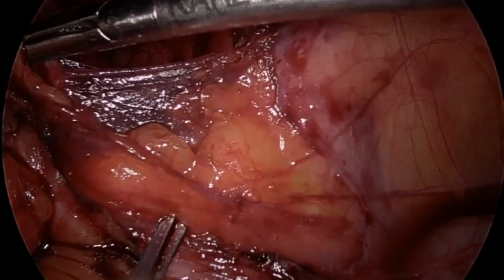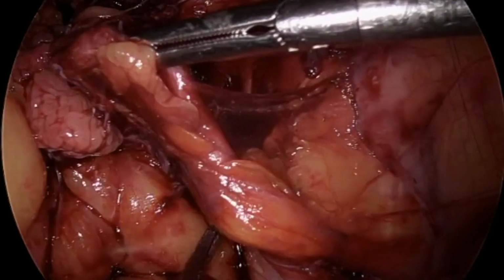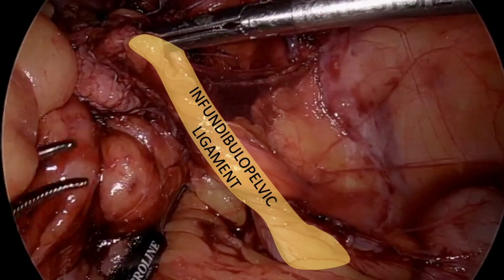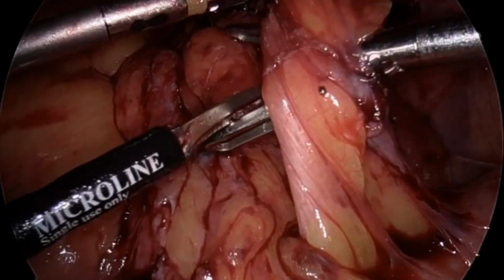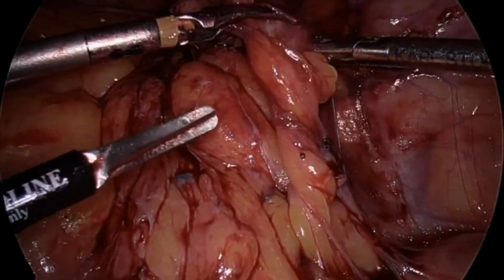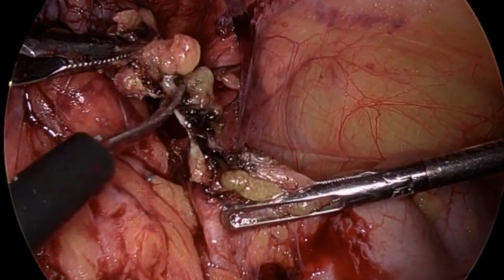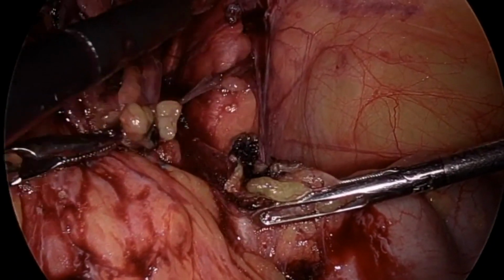To begin step 3, we must identify the infundibulopelvic ligament using anatomic landmarks. In this case, it was found superior to the ureter on the medial leaf of the retroperitoneum. To ensure no ovarian remnant was left behind, the infundibulopelvic ligament was sealed with electrosurgery and transected 2 to 3 centimeters from the ovary per risk-reducing protocol.